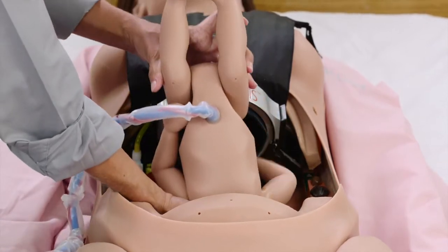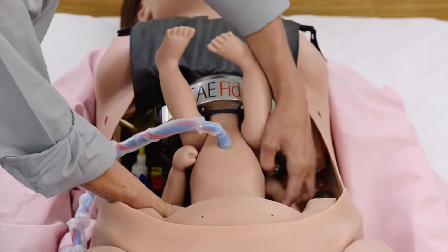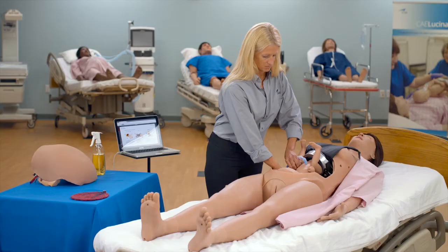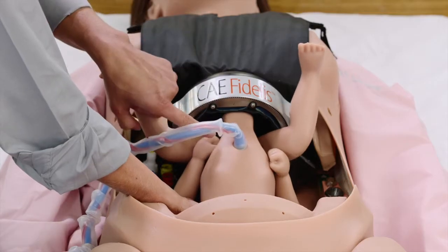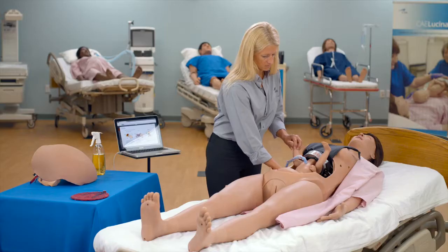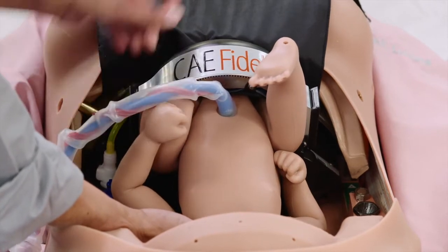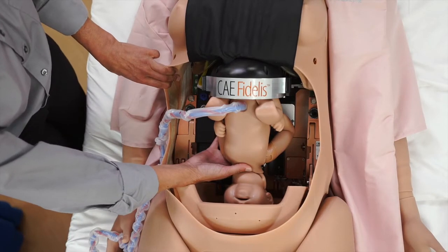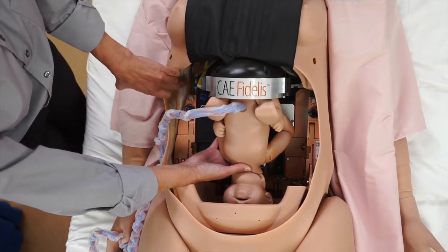Insert the fetus by placing the head against the delivery cervix and facing upright. Ensure that the fetus' arms are firmly adducted against its torso. Insert the buttocks of the fetus into the rotation ring up to the two dimples near the umbilical cord area. Bend the legs at the knees and tuck the feet into the rotation ring up to the ankles.